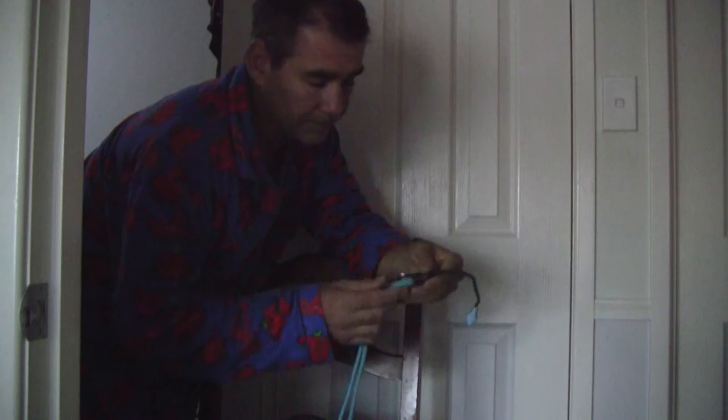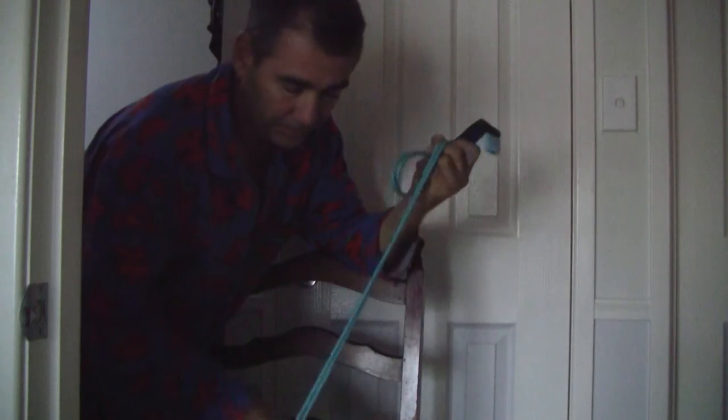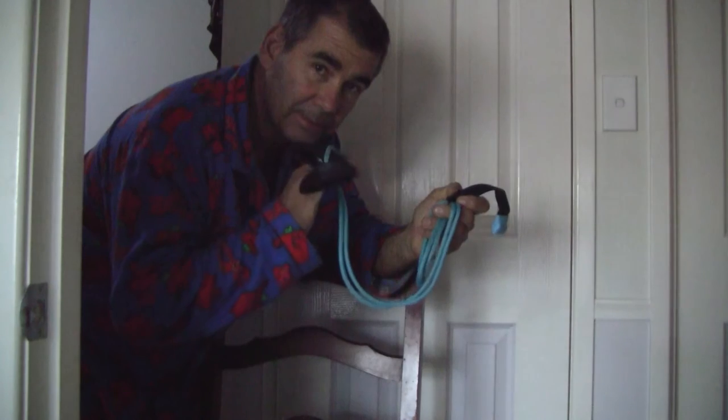It's six weeks today since I had my surgery on my shoulder — a rotator cuff tear, with a couple of screws put in. It's been a bit of a battle, but with the help of this gadget here, this pulley and two ropes, is the secret to my success.